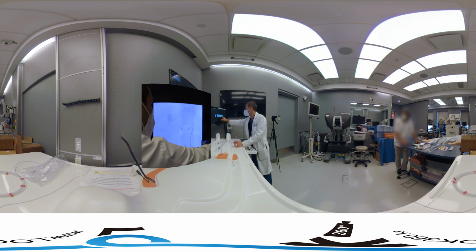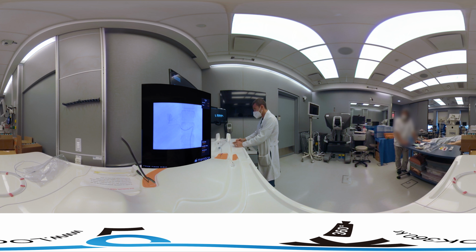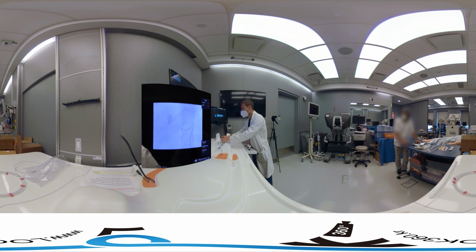What we will do is flush out what's left in the catheter with some saline, to make sure there isn't anything left. And again, we still see good staining of that tumor right there. So what we're going to do now is remove our microcatheter, and we're going to do another run now through our base catheter again, okay? And we're going to see what it looks like to see if we got a good result.